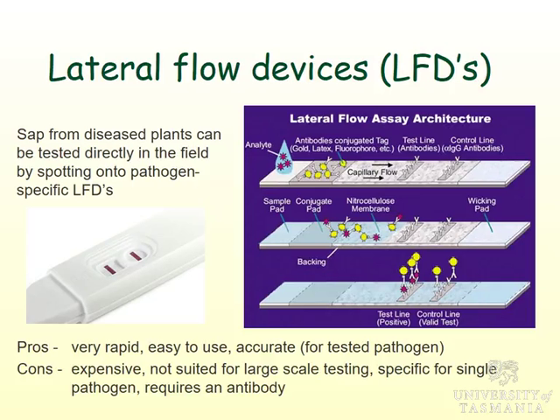So the control line detects the antibodies themselves, I think. So it's always going to work out positive. So you've added antibodies, eventually it flows down, they're going to bind to these ones. So these are antibodies that recognise antibodies. And antibodies are proteins, so you can get antibodies, if that makes sense.